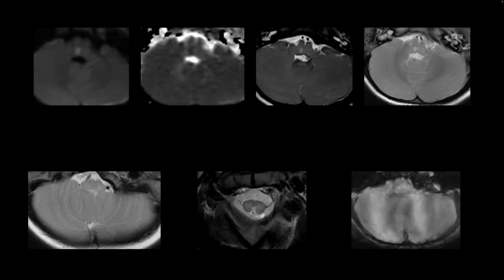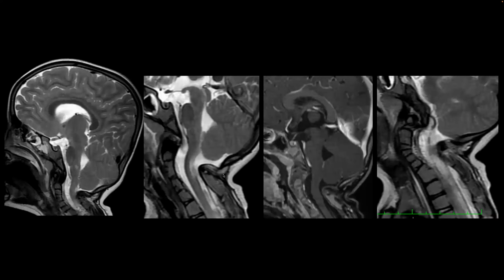But in the posterior part of the medulla, you have a cleft. It's a cleft defect, a congenital defect, isn't it? Yes. That's a congenital defect. That is not in question. And the sagittal imaging of that defect looks like a longish pathology, but it's not. Maybe I cannot explain what I mean. No, I understood. You're saying that this is CSF because of the cleft. Okay. This has nothing to do with this patient's condition now. This is congenital. So we have just a tiny brainstem infarct.